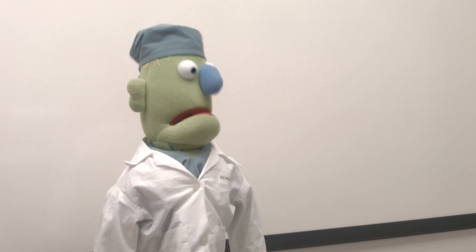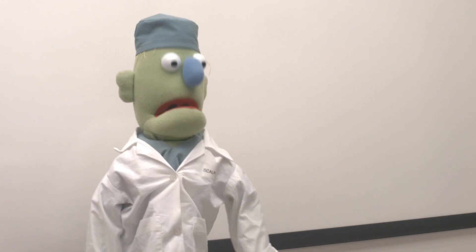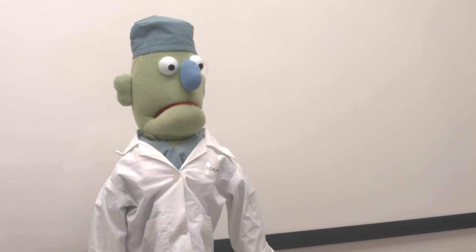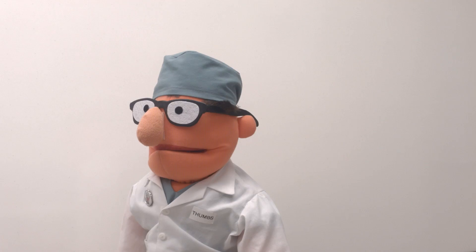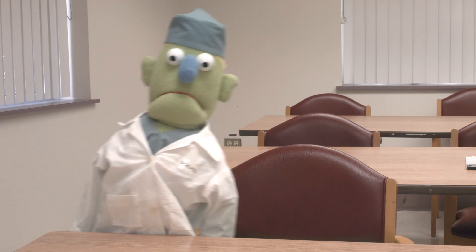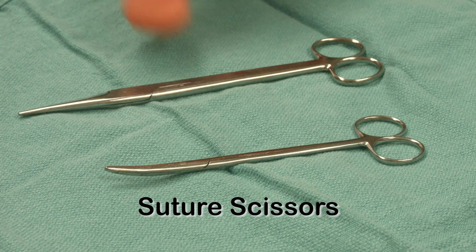I know we have some scissors around here somewhere. There they are. It's been a long day, so I'll sit down for a change, and Thumbs can do the honors. I'll add my pearls of wisdom as required. I love to teach. Okay, Alex, let's talk scissors.